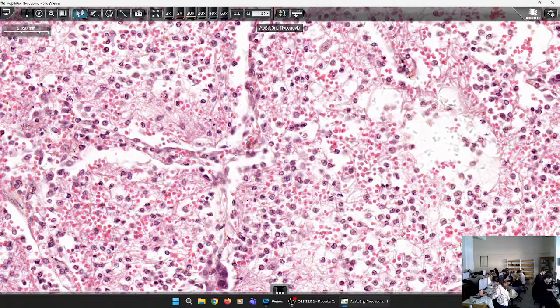In this case, most probably, it is a bacterium, Streptococcus in most cases. So, the capillaries within the intra-alveolar septa are congested. This is the first sign of inflammation, because a lot of blood goes to the tissue where damage was done.